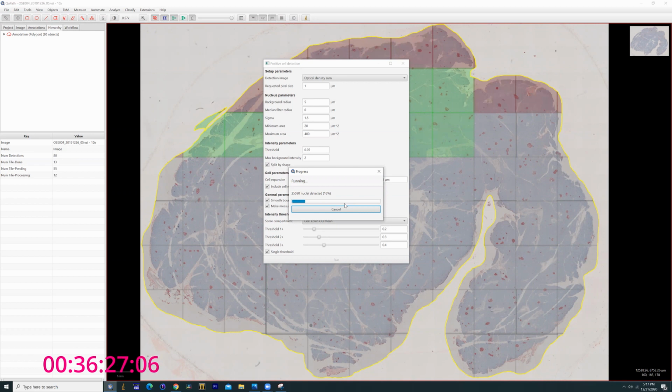This first pass is just to see how the overall scans work under the conditions we defined in that first attempt. What I'm concerned about is that you can see the base is tissue. I can see we have this connective tissue, maybe fat or maybe damage that was done during the mounting.